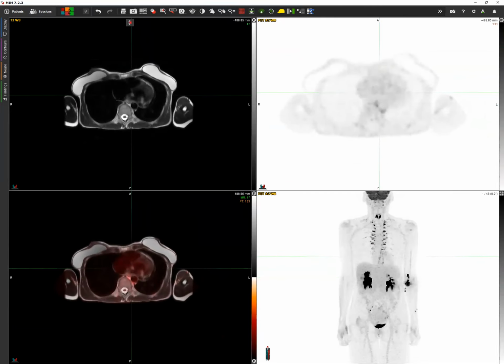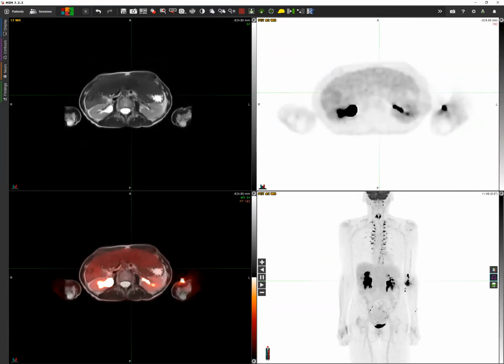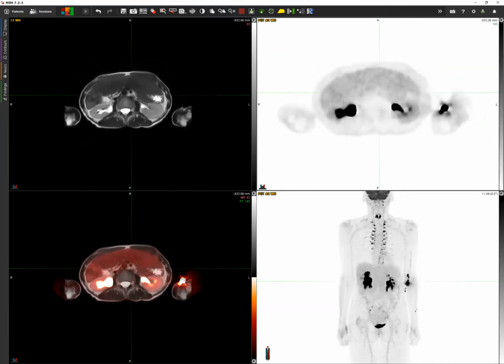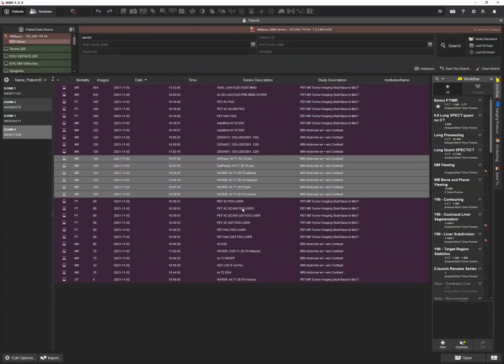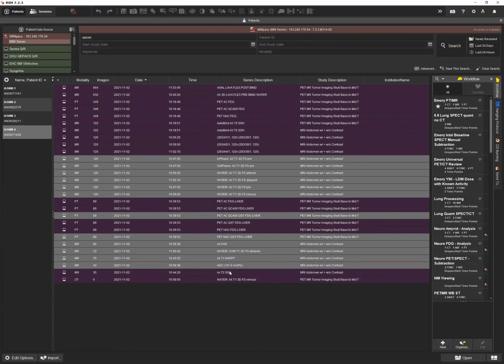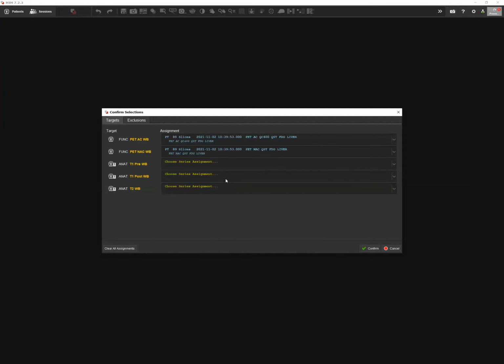And yes, this is our patient that I showed earlier with the cholangiocarcinoma Y90, right? So you can see the whole body decent, but it's really the power of the PETMR is shown off when you do the liver lesions. So let's throw in our livers. And this one won't take nearly as long, I promise.